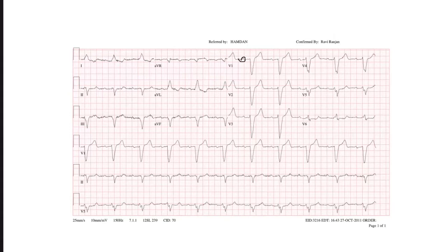Okay, so Derek has marked a P wave. They're a little bit harder to tell on this one, mainly because right here is a little bit noisy. You can kind of see it. So there's P wave, P wave, P wave, P wave. Did we do heart rate on this one? Yeah, Tanner did. Okay.